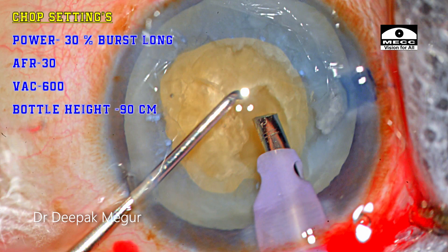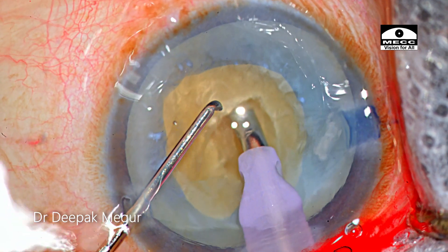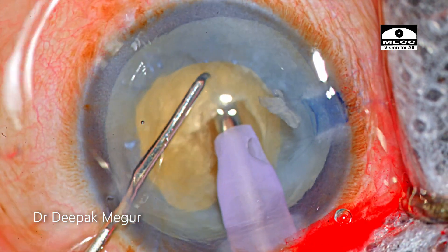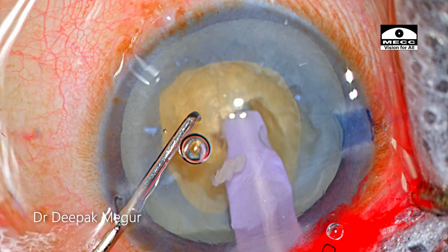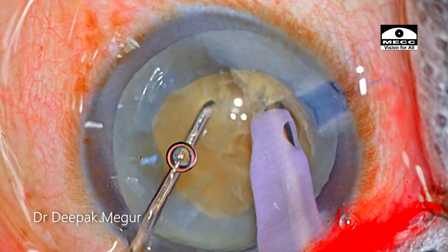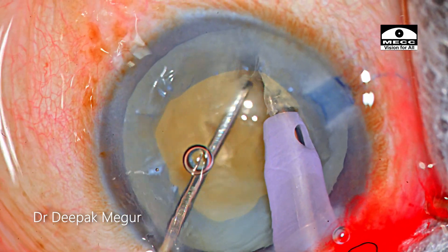When going for the chop settings, the power is changed to longitudinal and it's in burst mode. Once I know the depth of the tip is quite adequate, I give a short burst of phaco energy to bury my tip as deep as I can — the entire tip up to the sleeve needs to be buried to get a firm grip on the nucleus. Then the sharp chopper just goes down and makes a lateral movement, giving us the first crack.